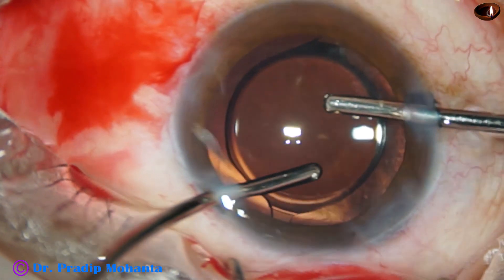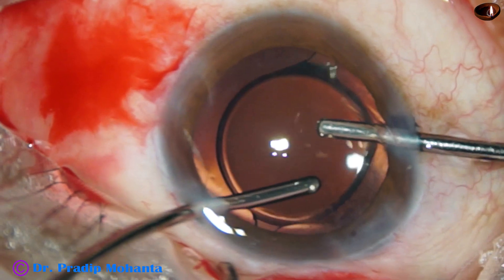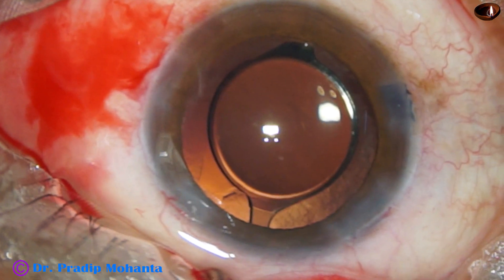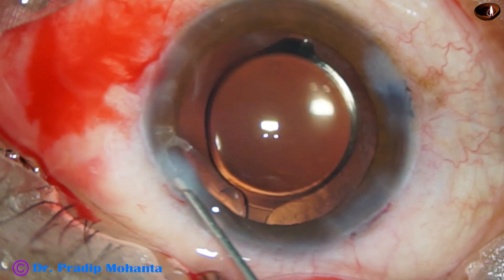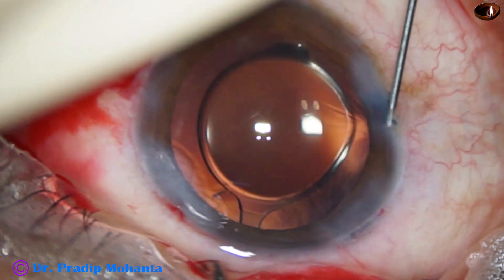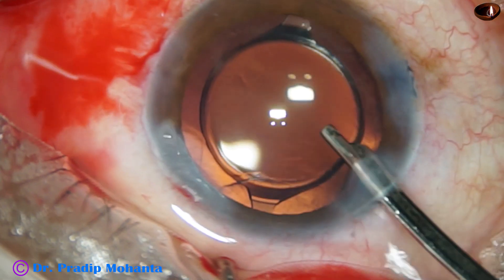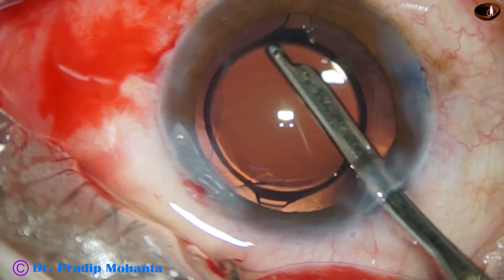Irrigation and aspiration are used together again. The lens has rotated a bit but it is okay — it is nicely centered. The sideports are closed very nicely. The main wound does not require any hydration. This is the final lavage of the anterior chamber, which removes any viscoelastic molecules adhering to the corneal endothelium.